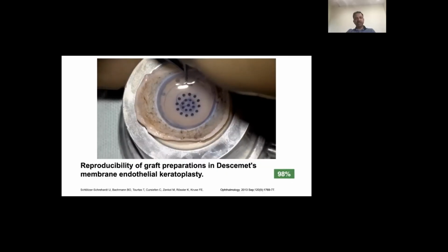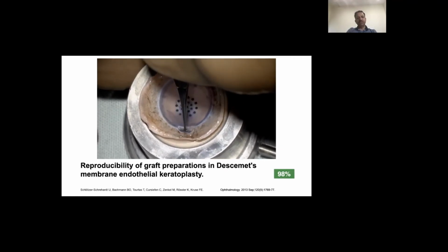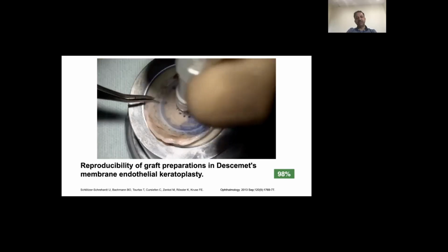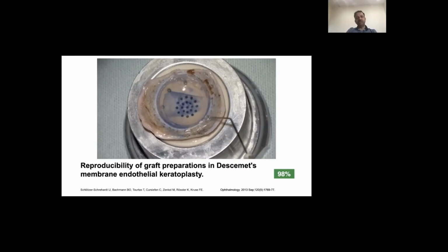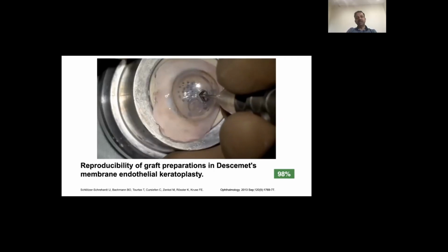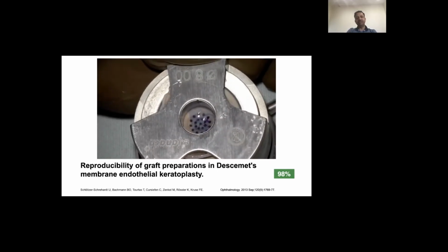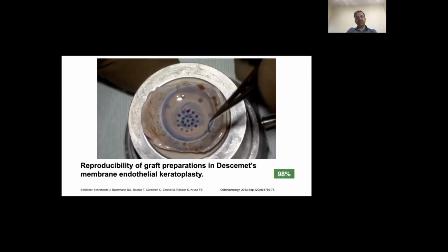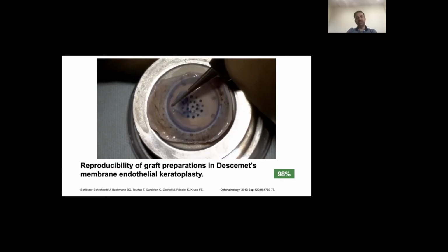In terms of donor preparation, here in our country, the eye bank does not give us pre-stripped tissues. So we perform the stripping of the donor prior to surgery. You can make a partial trephination, a large diameter trephination, then do a partial peel of the Descemet's, then you create a stromal window. The stromal window is basically to access the stromal side of the Descemet's membrane, where you can create an S or an F stamp, and then you go back and do an 8 millimeter partial punch. The peripheral rim of the detached DM is removed, and then the final stripping is completed, and you have your 8 millimeter donor DM that's completely free.